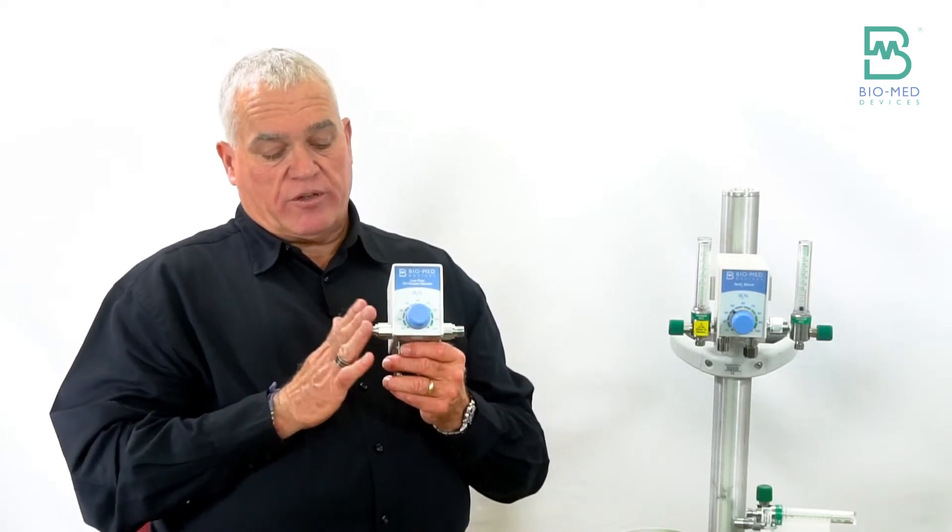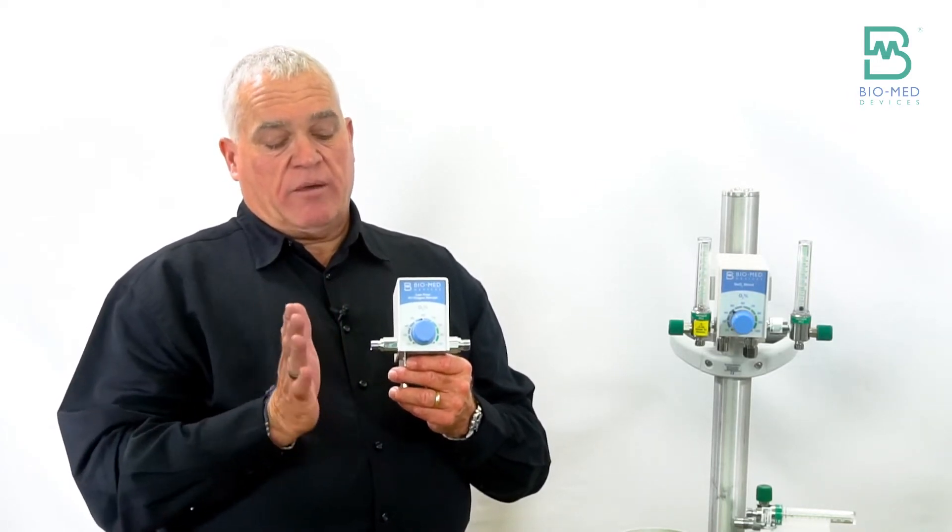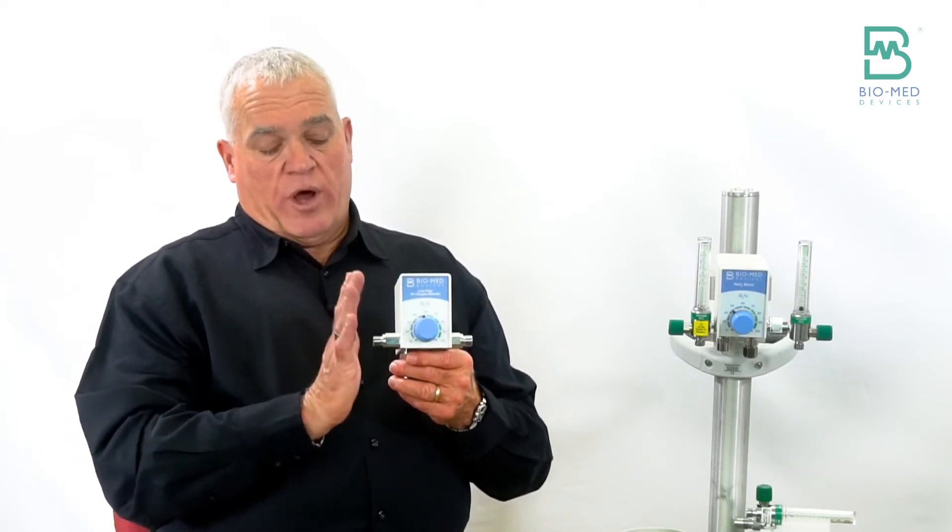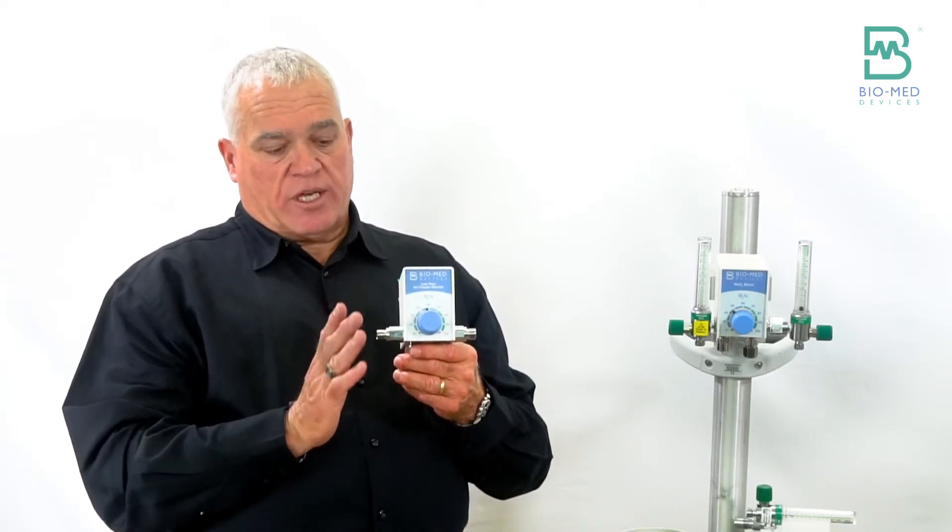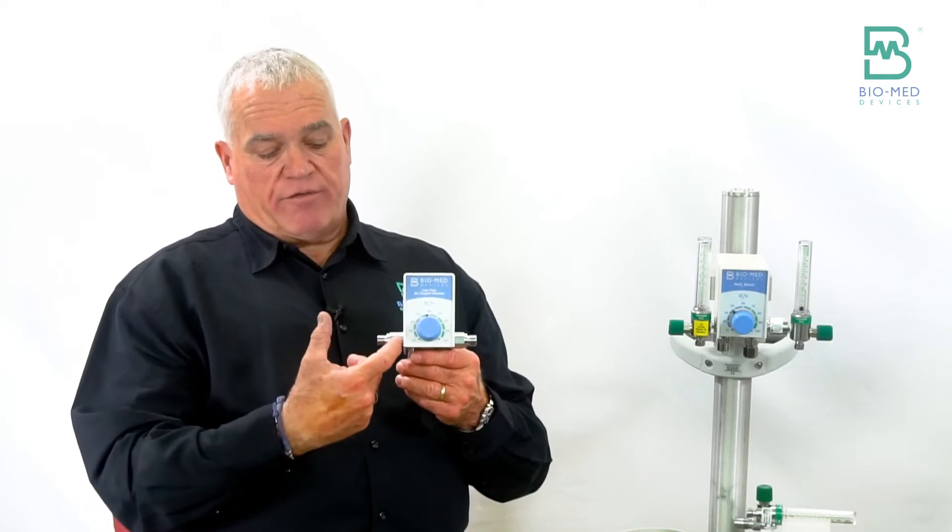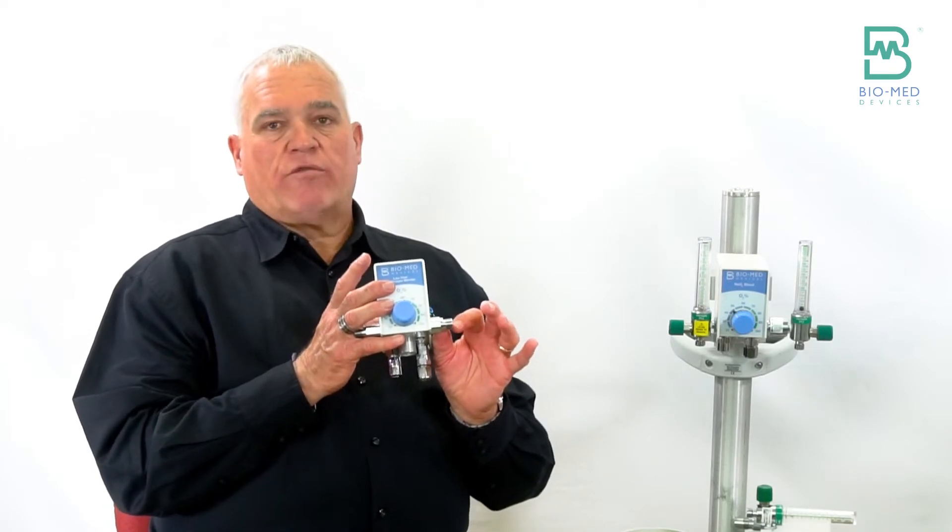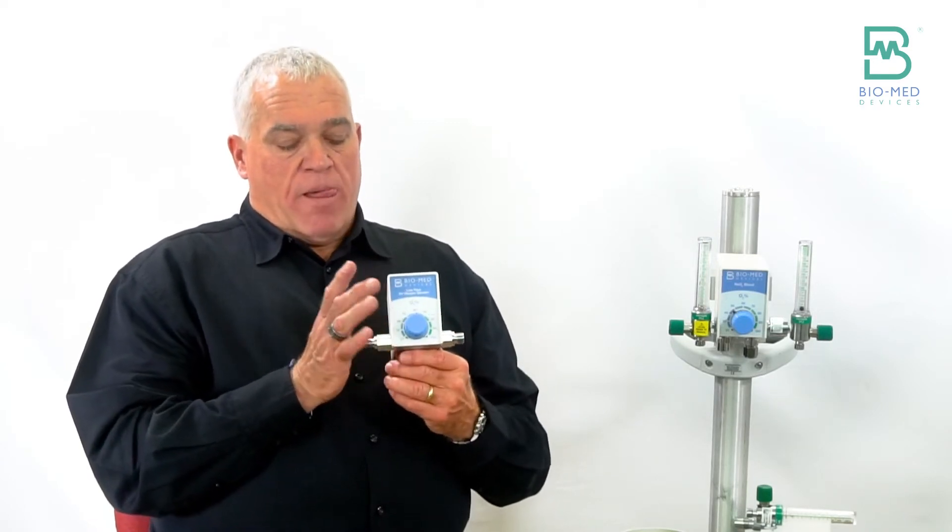It has a port on either side. Of course, this blender you can't really use until you add your flow meters. So typically people will put a flow meter on either side. One you'll usually connect to resuscitation bags, so you might have a zero to fifteen liter flow meter on this side and say a low flow on this side to do a low flow nasal cannula. The problem is when you put these flow meters on, you're kind of hanging out to the side just because you have to screw them on.